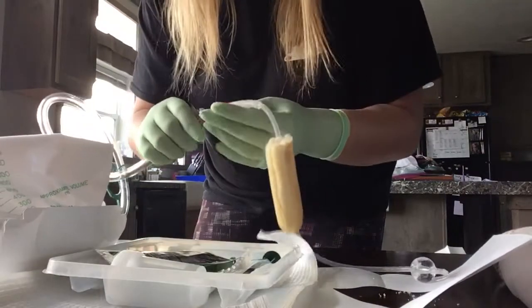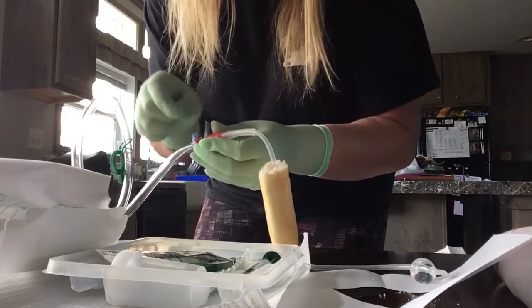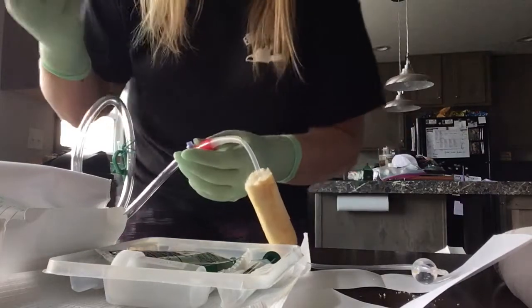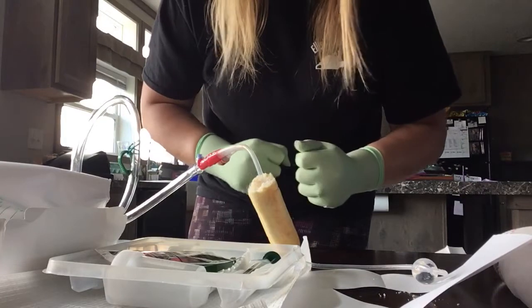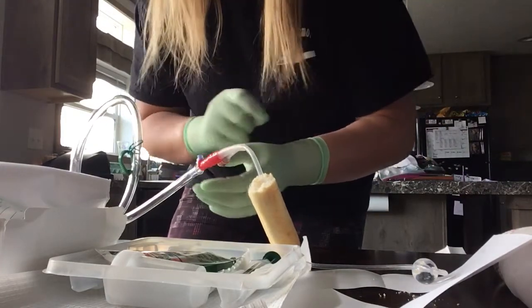If you want to take a clean sample, make sure that the port is clean with a wipe, then put your syringe on it, take your sample out, and make sure it's clean again. If you want to irrigate, you do this in the same port, but make sure you clean it first.